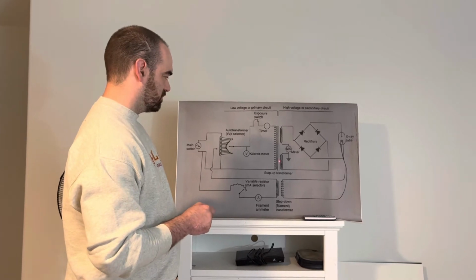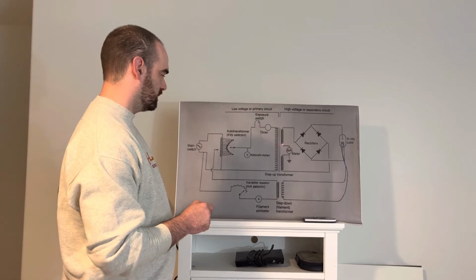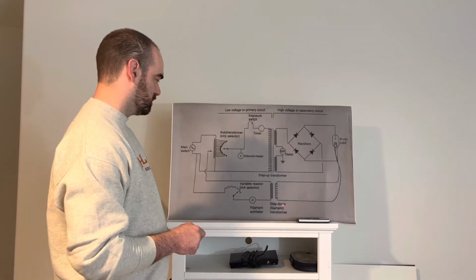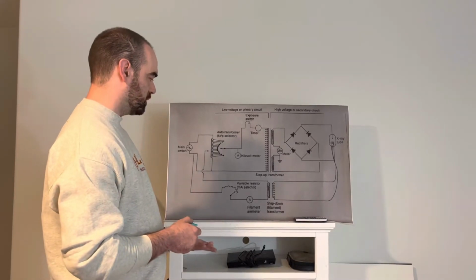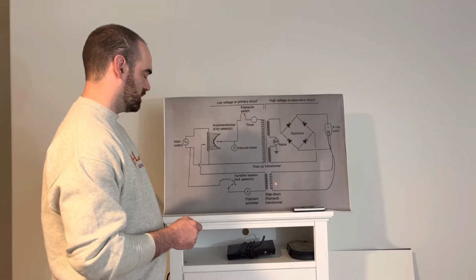And if I haven't already mentioned it, the step-up transformer will be induction number 3. Now we'll move to the filament side and the step-down transformer. A step-down transformer works pretty much the opposite of the step-up transformer, with more coils on this side and fewer coils on this side.